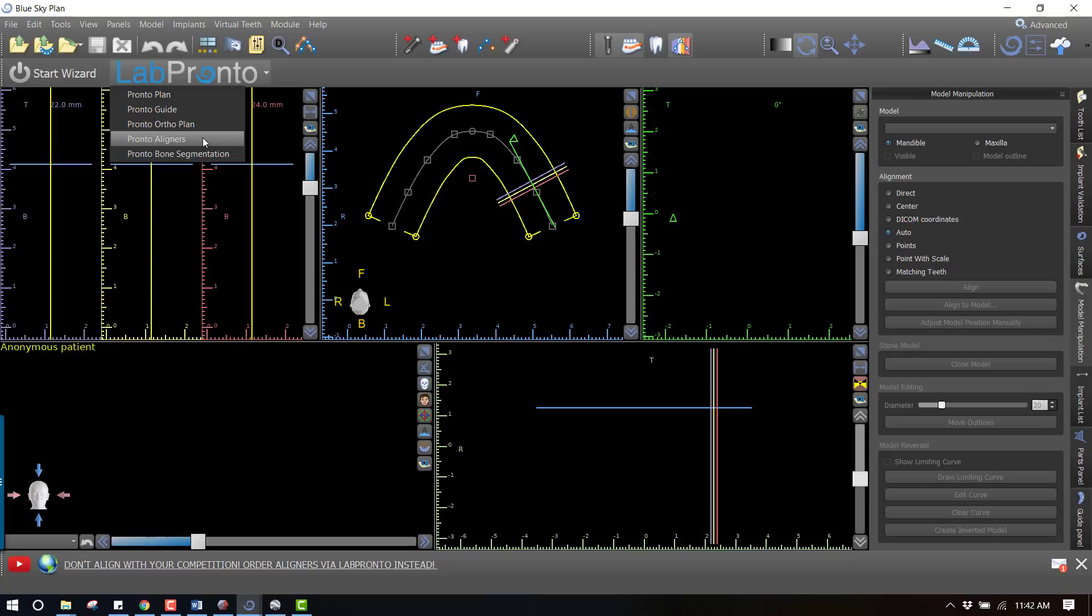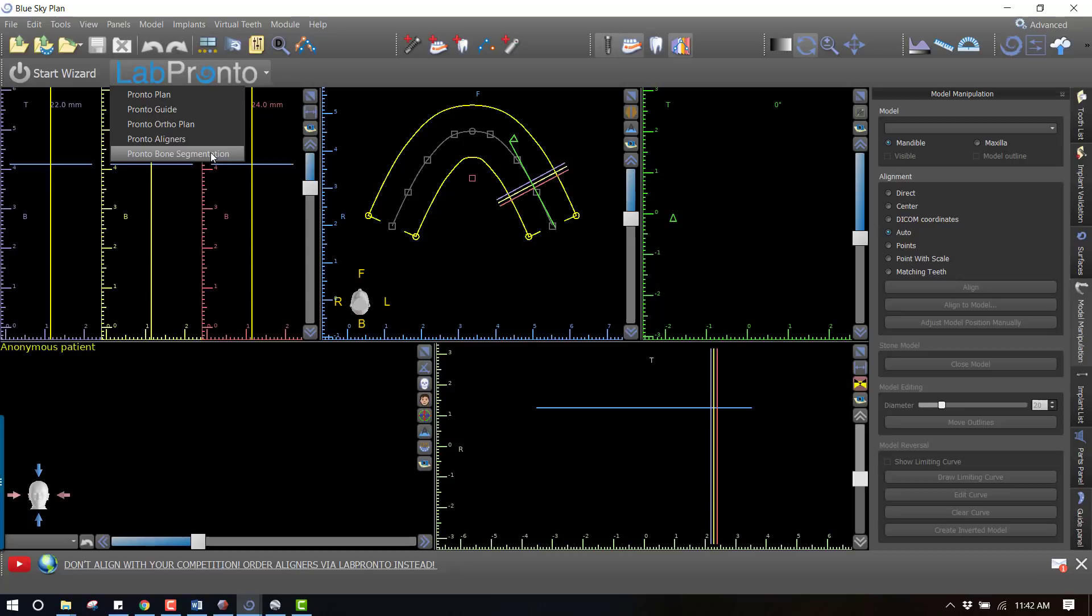If you have a printer and you want to print these models you could just make the aligners in-house and it'll be more affordable, but if you don't even want to fabricate those then you could outsource anything else. Then finally the bone segmentation - if you want to do bone-supported guides anything like that, all of those services are currently available. Very soon we'll be offering many other services such as wax ups, crown designs, bridge designs, all of that.